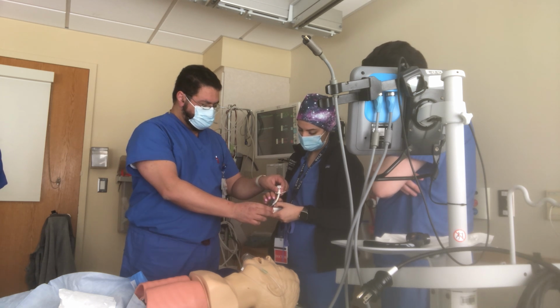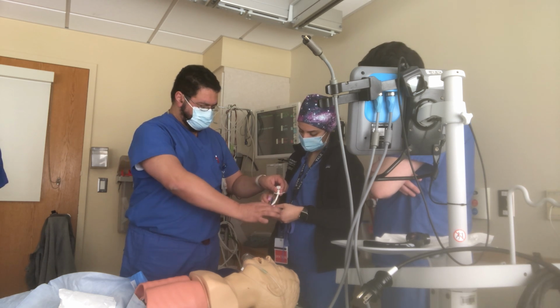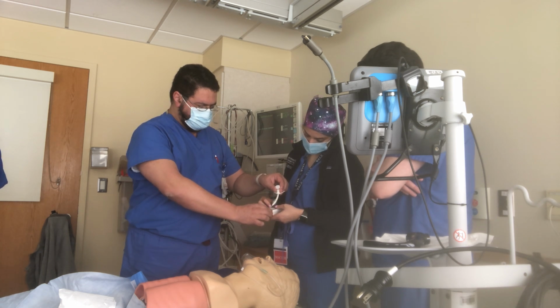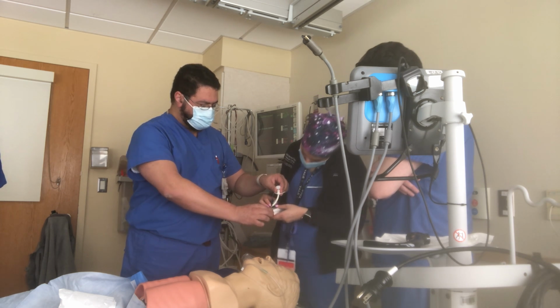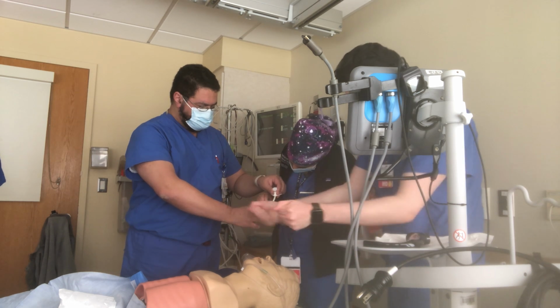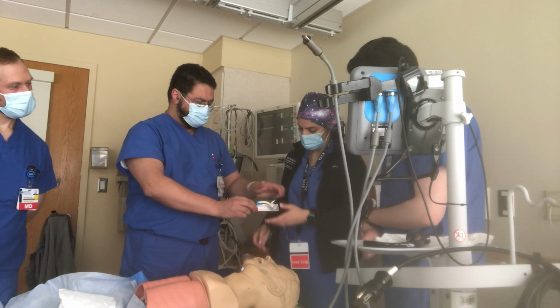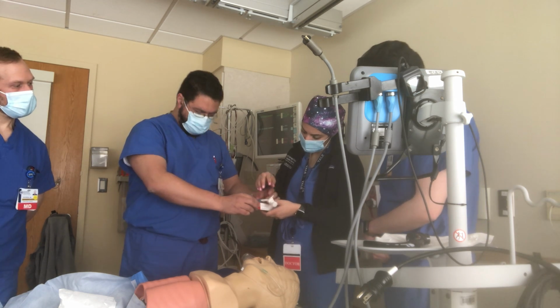Oh, okay. Remove the two sides. Got it. Break them and remove. No. Break them. Pull them apart. Like separate them. Separate them. Yeah, exactly. Okay. And that remains inside like this. Okay. Right? And then you have a scalpel here.